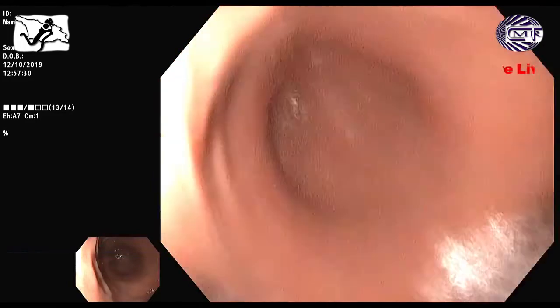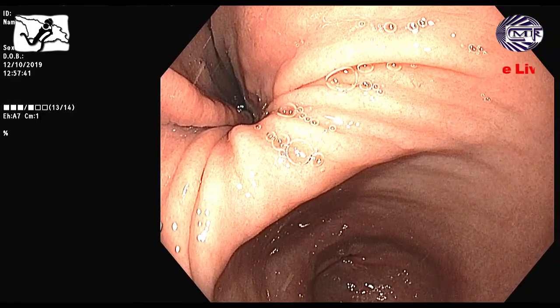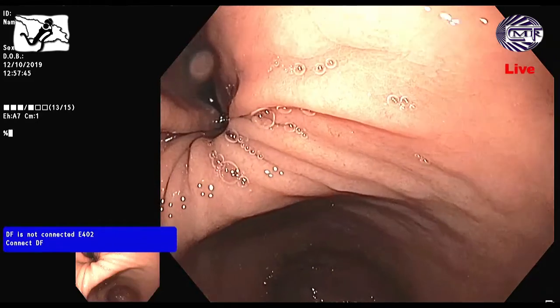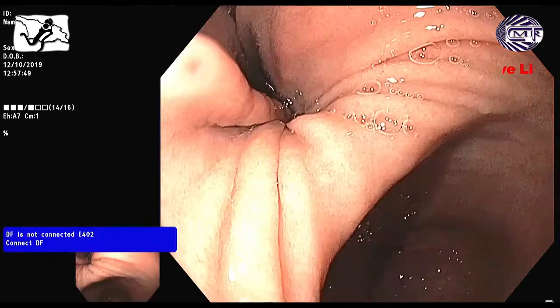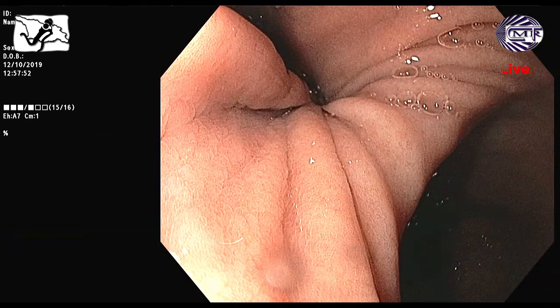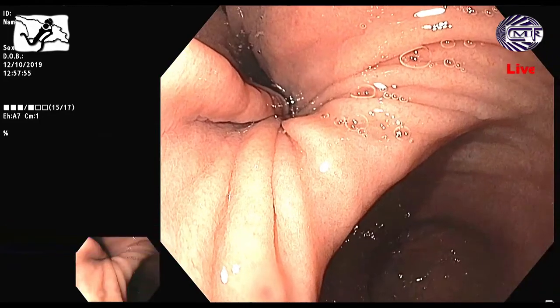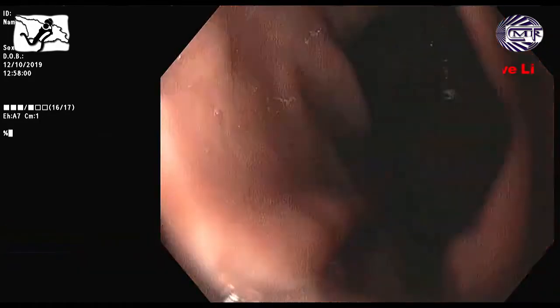And yes, a little bit pull back, check angle. Angle. Yes, just a moment. Little bit more inflation. Okay, center of angle. And posterior side here. And anterior side, right? For the angle, I divided 3 quadrants, 3 parts, right? And then pull back.